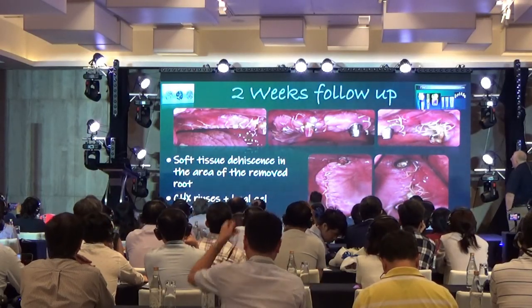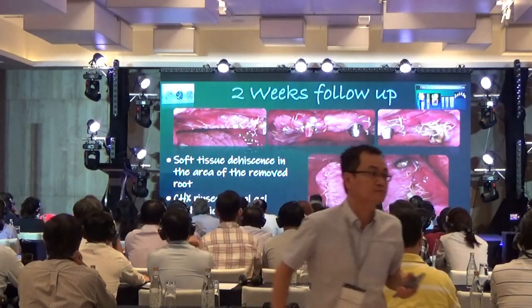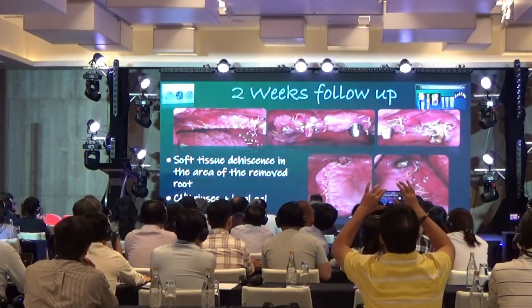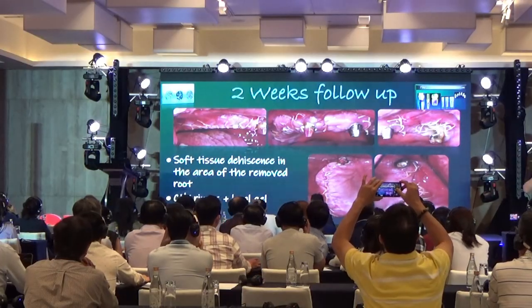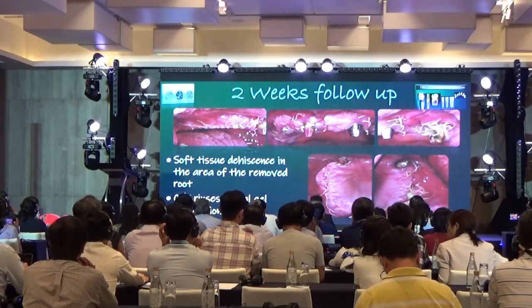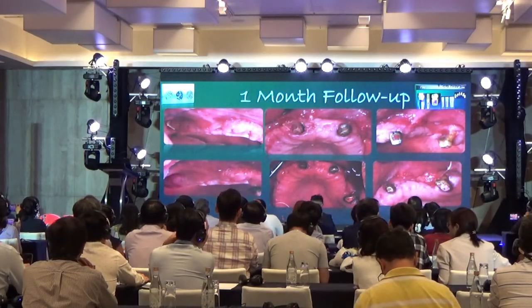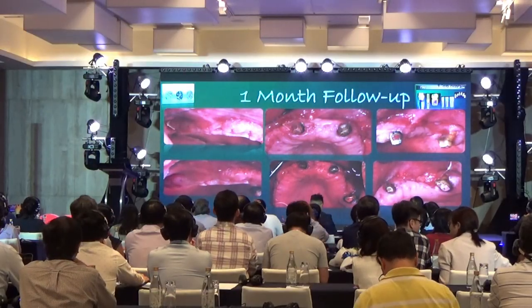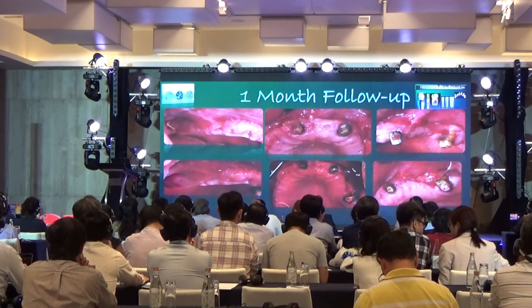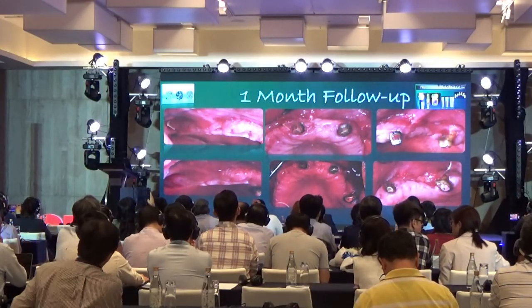Well, during the follow-up, we have some soft tissue dehiscence. You can see it over here. But as I said before, we do not touch it. We just leave it, keep it clean, and slowly soft tissue will grow up there. And you can see that soft tissue eventually healed. And you can see also that the number of abutments that we have in the upper jaw is not so good.